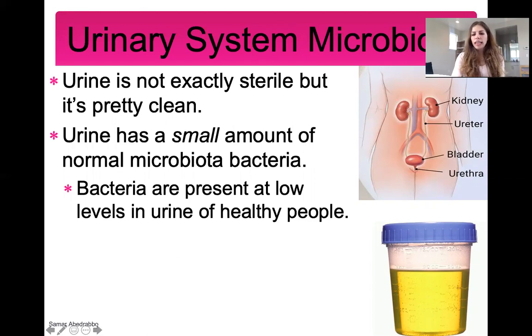And urine from healthy individuals should look like this. It should be transparent and not foggy. Anytime you see urine that has an odor, or it looks foggy or turbid, that means that there is an infection, that there are organisms, usually bacteria, growing in there, and the bacteria are doing some sort of metabolism that gives it an odor, as well as growing. That's why it looks turbid or cloudy. So anytime you see that, it indicates an infection.